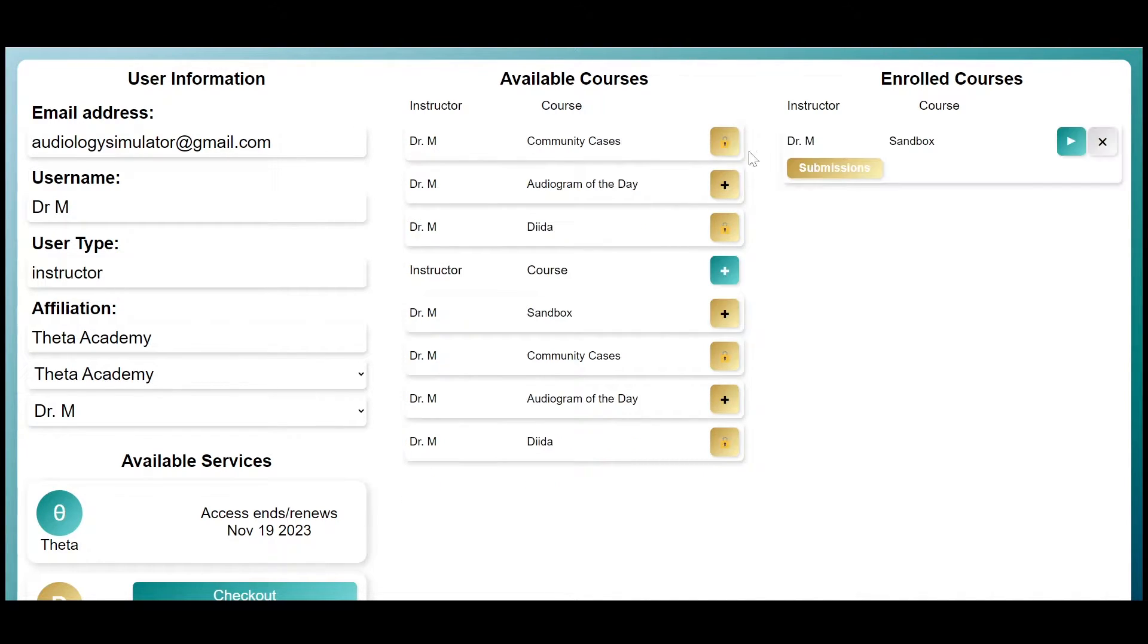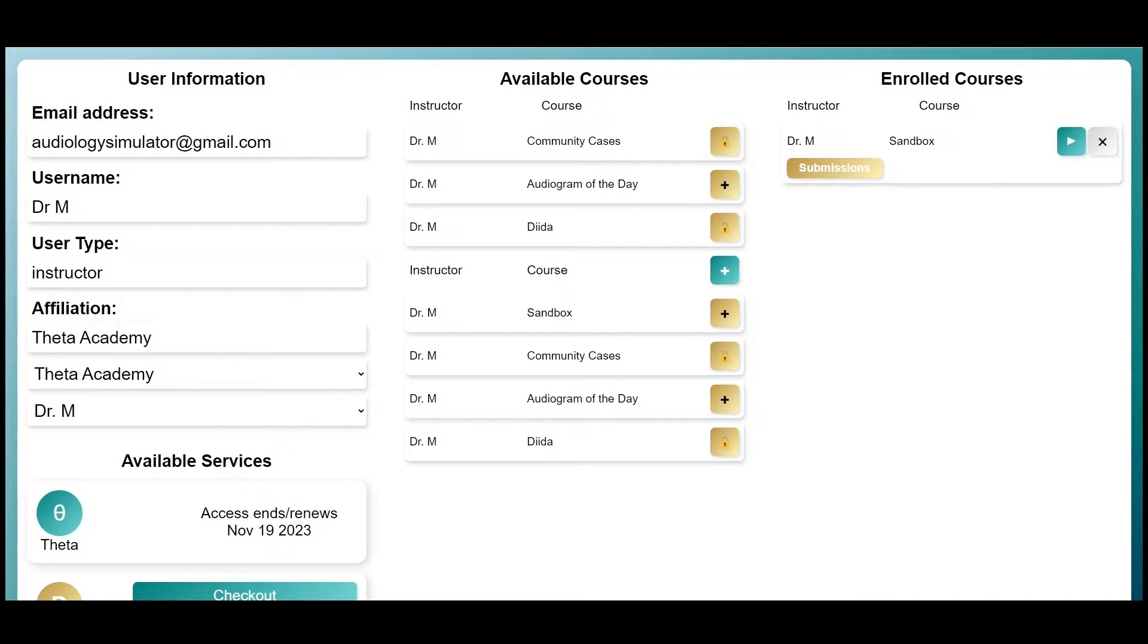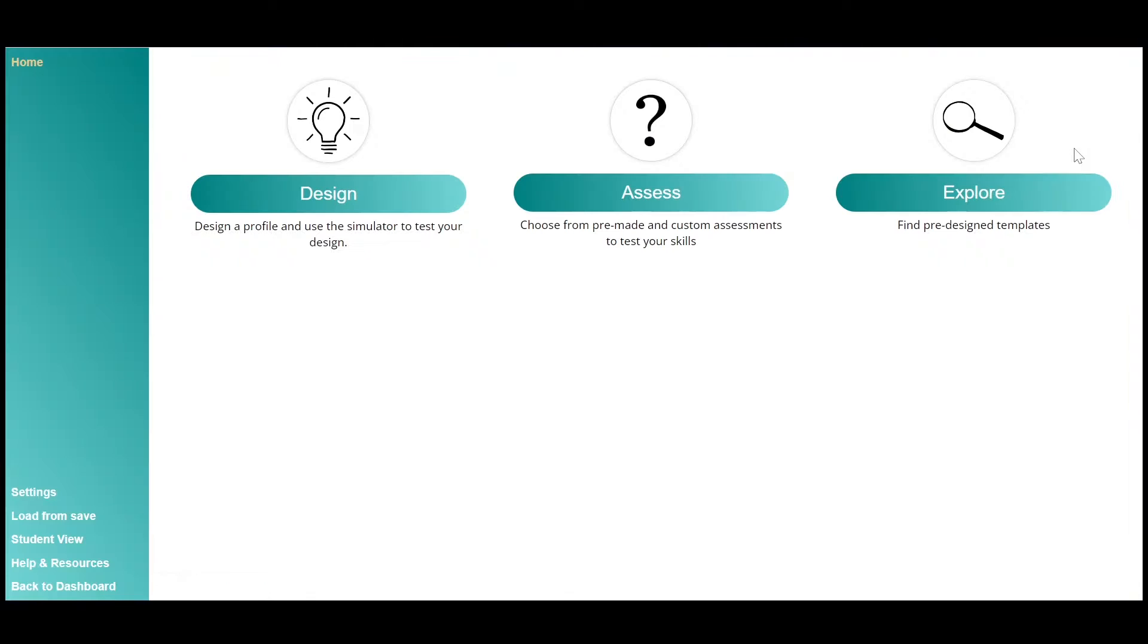where you can manage your account information, view available courses, and enroll in a specific course to jump into the simulation.